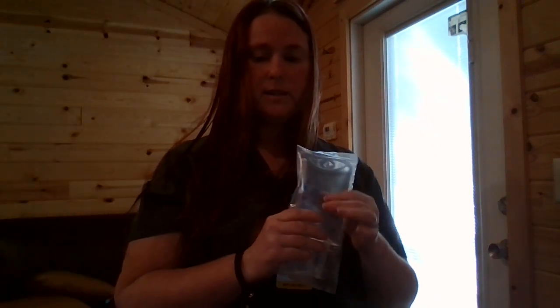I have my 0.9% sodium chloride, 250 mLs, and then this is my piggyback of amoxicillin. So in my video, I'm going to hang 150 mLs of fluid, and then I have an order to give 250 milligram amoxicillin in IV of 100 milliliters normal saline over 15 minutes. So that is what I will be demonstrating.